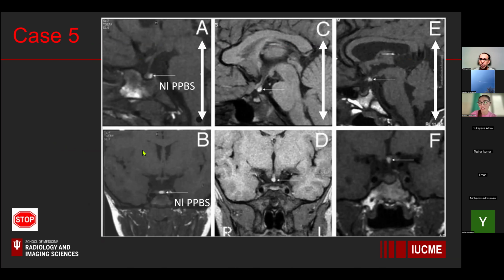Okay, and I start with this case because it's important and you may not see it in clinical practice. It's very academic, but I wanted you to at least know this, especially as you see pediatric patients and you're rotating in neuroradiology on the pediatric service, you may see this case more commonly.